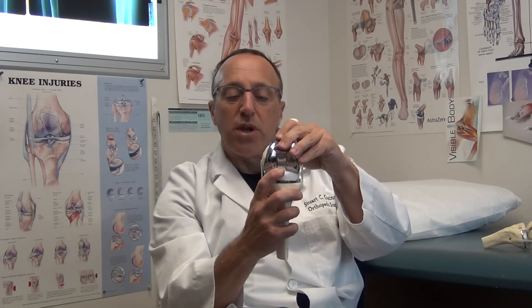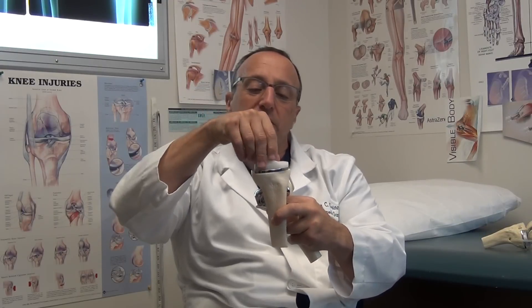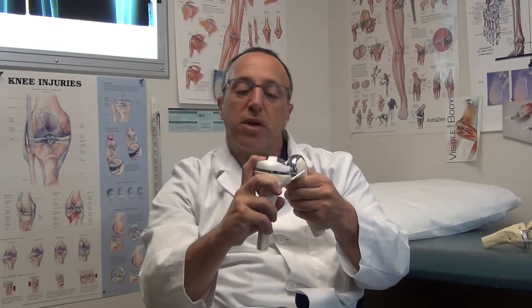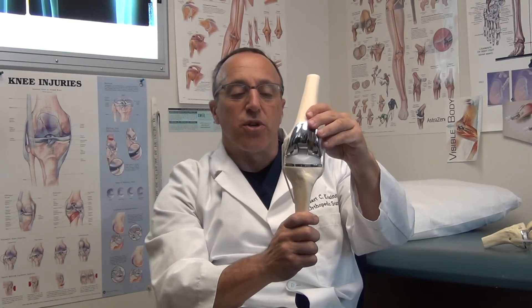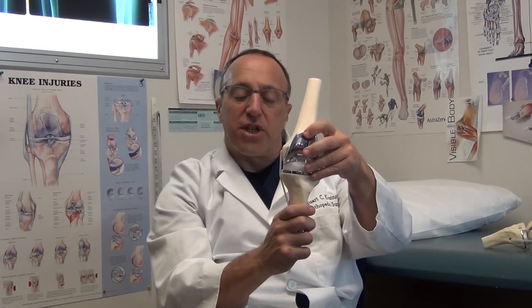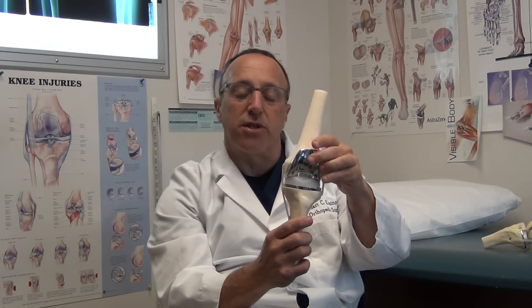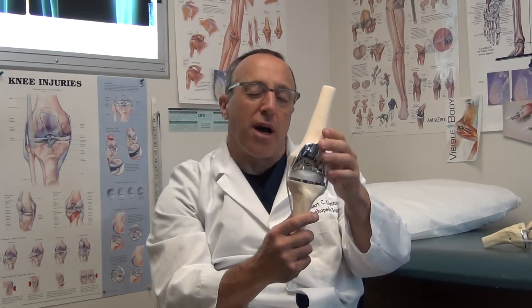I also believe that the floating plastic — I'm going to show you how that works. The plastic is free to float, and because of that, it dissipates stresses better and decreases the overall wear on the implant. I believe that the knee will last longer because that plastic is able to move. We call that a mobile bearing. About 30% of my total knees are mobile bearings. The other 70% are still fixed bearing because those patients don't really need the extra rotation, and it is more complicated to do.